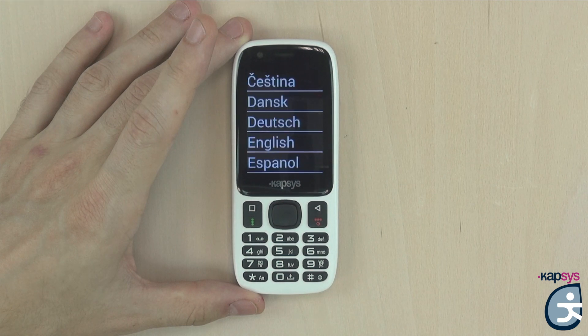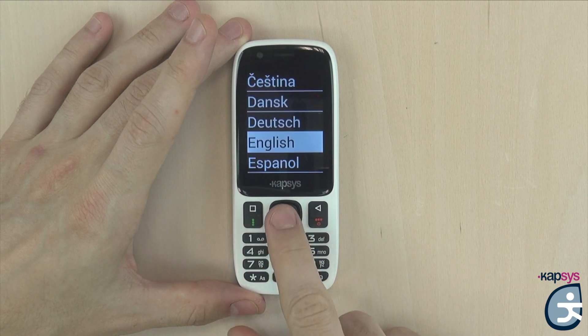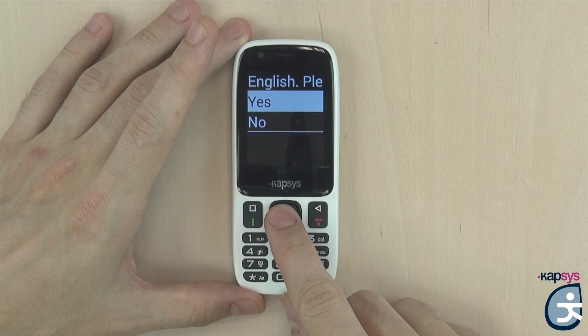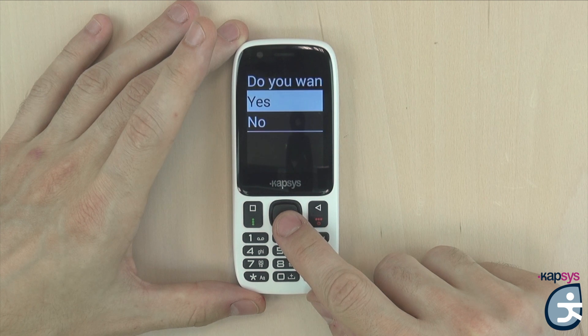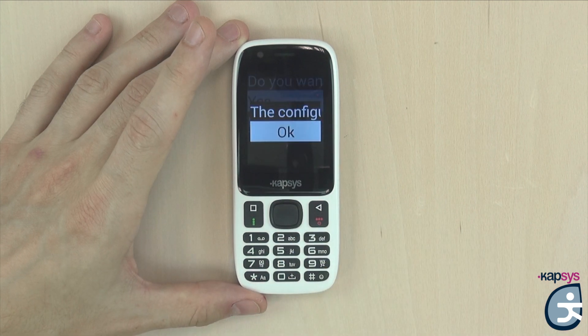We will have the language selection screen. The list of languages is sorted alphabetically. We will use the down key on the joystick several times to reach English, and confirm our choice by pressing the OK key. A confirmation window appears — use the down key to select Yes and confirm with OK. The last step is the activation of speech synthesis. If you want the phone to vocalize each selected item, like incoming calls or messages, select Yes and confirm with the OK key. The configuration is now finished.